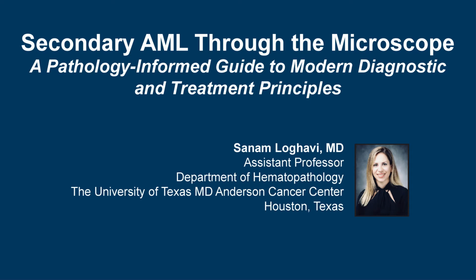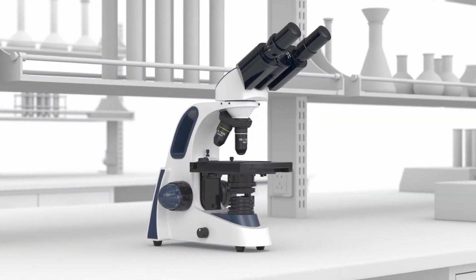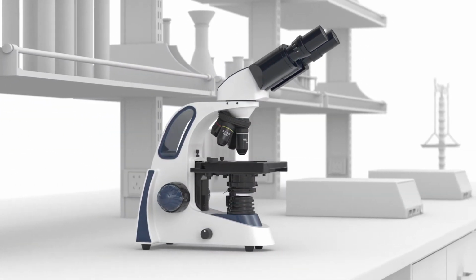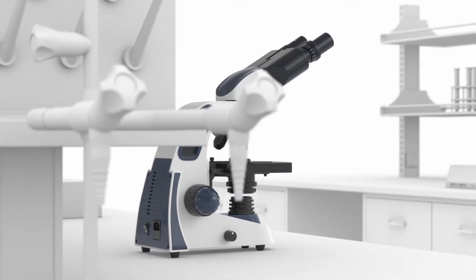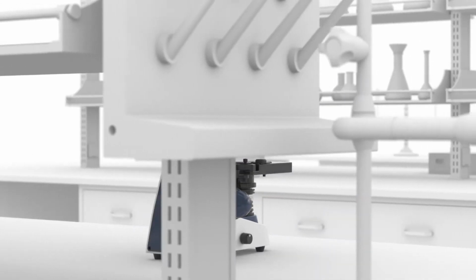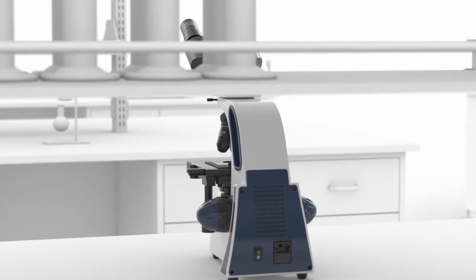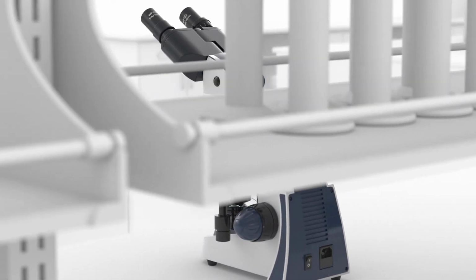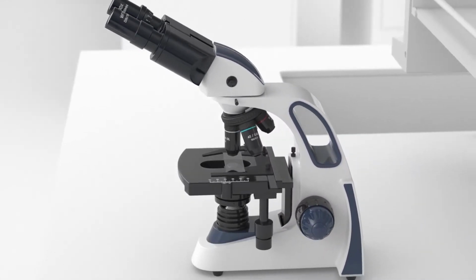Welcome to Secondary AML Through the Microscope, a pathology-informed guide to modern diagnostic and treatment principles. In a few moments, we'll take a trip together through the microscope to explore one of the more challenging and historically difficult to treat subtypes of acute myeloid leukemia that we refer to as secondary AML. The good news is that now we have modern tools for accurate diagnostic assessment, as well as therapies that are more effective than the conventional chemotherapy options we used in the past.